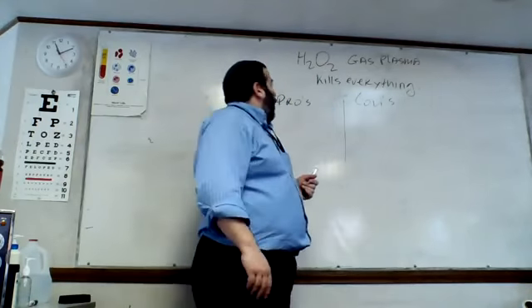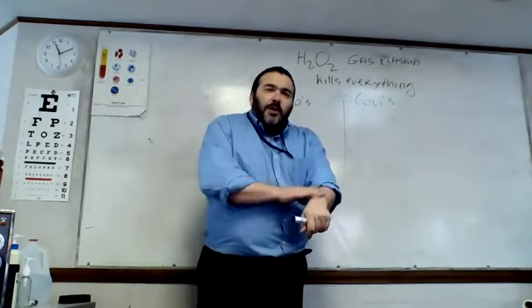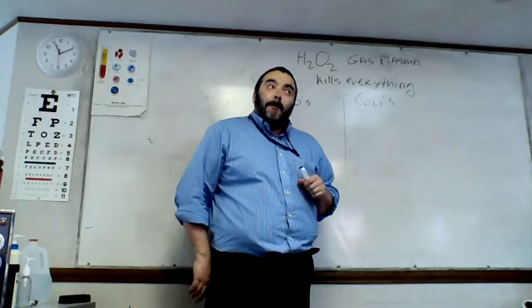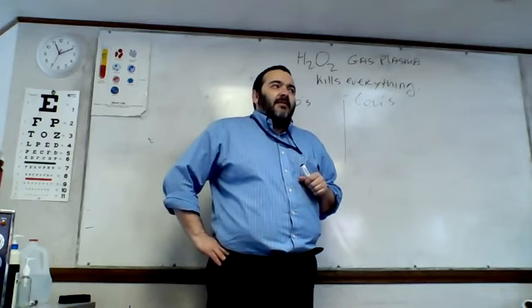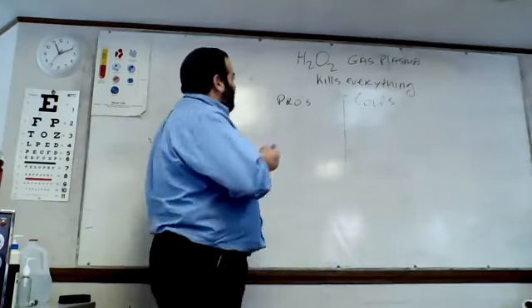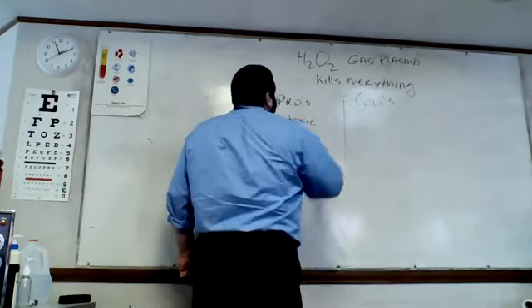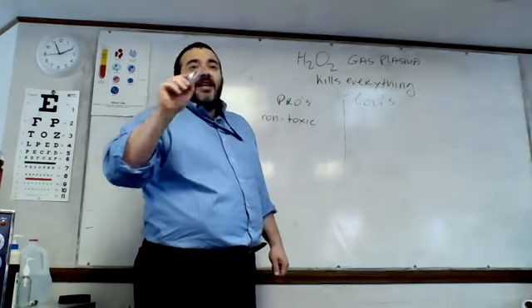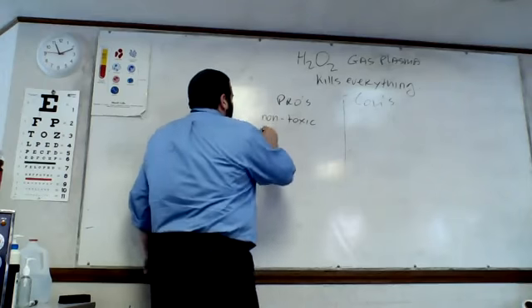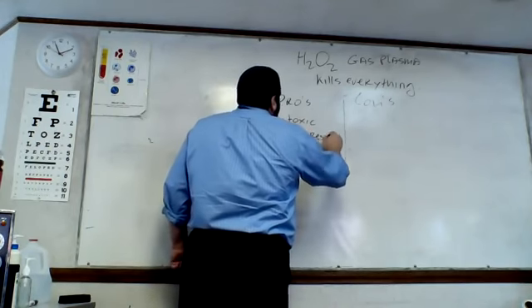All right? So, but you also know that it's kind of benign. You can put it on your skin. So, is it toxic? No. So let's put that on top. Non-toxic. And if it's non-toxic, unlike ethylene oxide, it does not leave a toxic residue. No toxic residue.